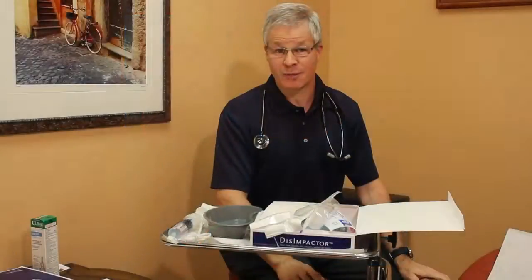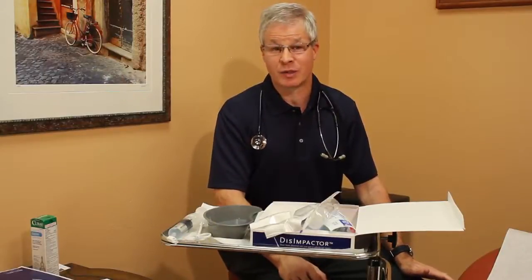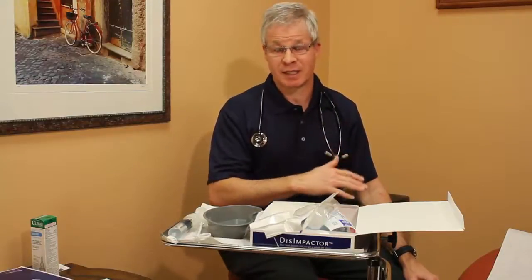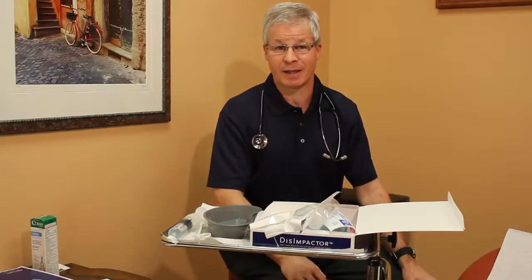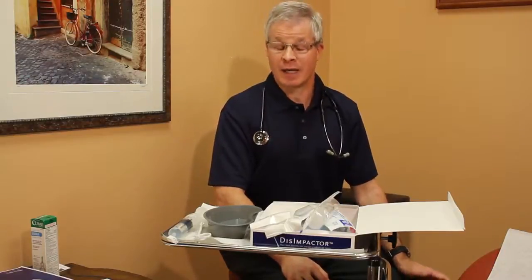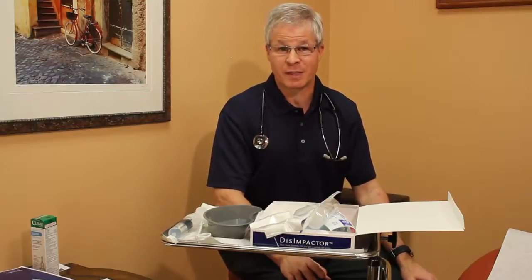This time, now the patient has the enema fluid inside, and we'll want to give them the standard 5 minutes or so to allow the enema fluid to work, at which point someone will assist them to a bedside commode or pan and look to see if they've passed the entire fecal load. A great number of patients will, at that point, have a massive bowel movement with relief of symptoms, and that confirms passage of the fecal load.